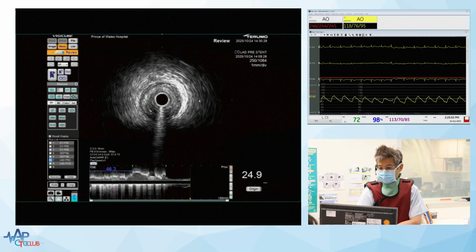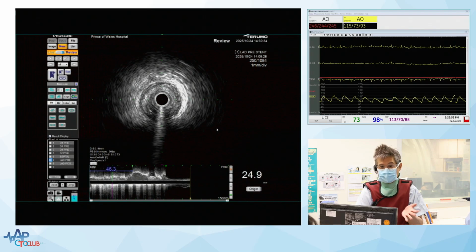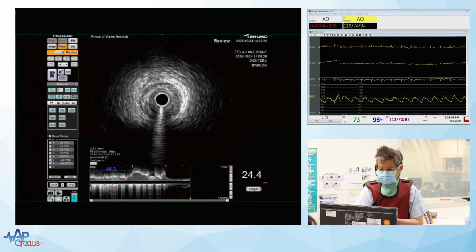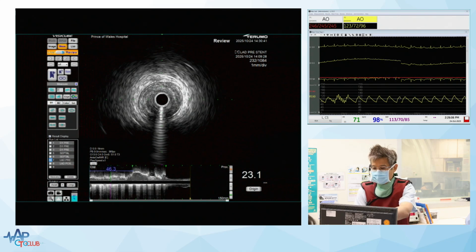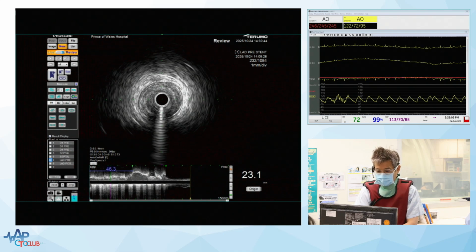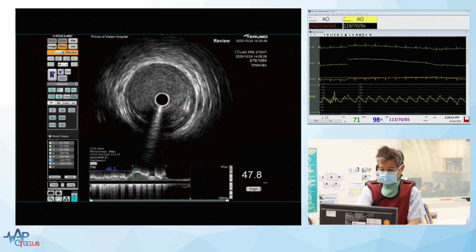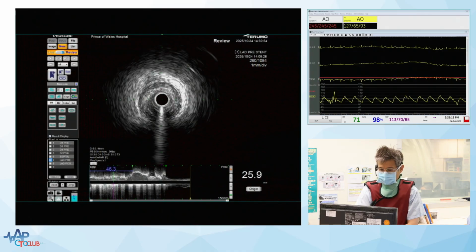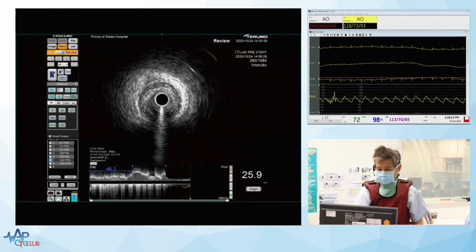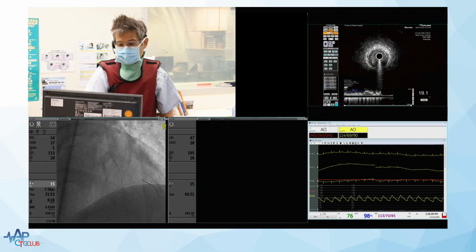And here I'm also looking at anything outside. Is there a myocardial bridge outside? A myocardial bridge will mean that I want to stop before that. So I think down here the plaque volume is actually not large, and you're starting to get this slight brightness, the PMB. If I was doing IVUS guided, I would probably put about half the length of stent, from the ostium of the diagonal down to around here, where the plaque volume suddenly decreases and this perimedial band starts coming up. This will be an 18 or 19 millimeter stent. And then the distal, I would DCB.